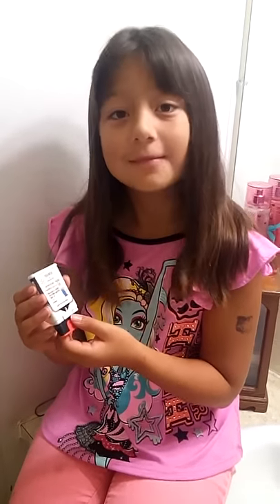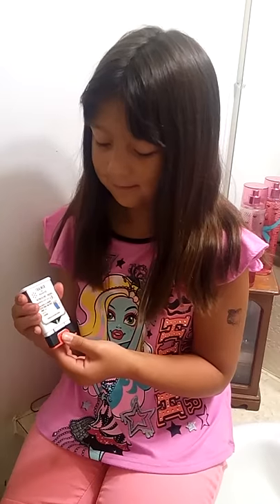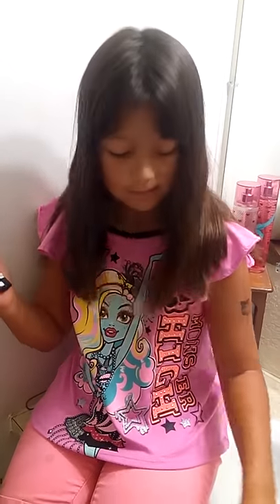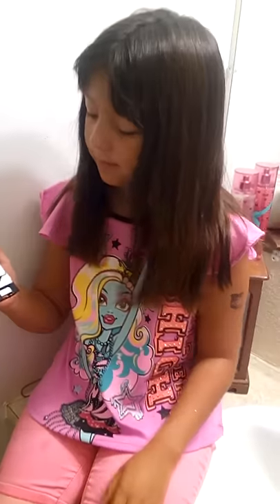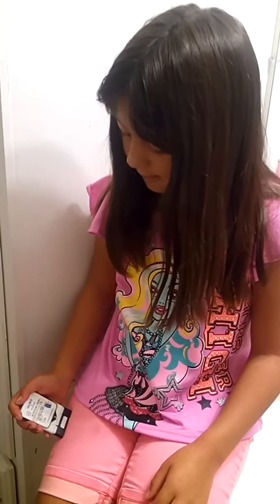If you are ready to use, pull off the red safety guard. Place the black end against the outer thigh, then press firmly and hold in place for five seconds.